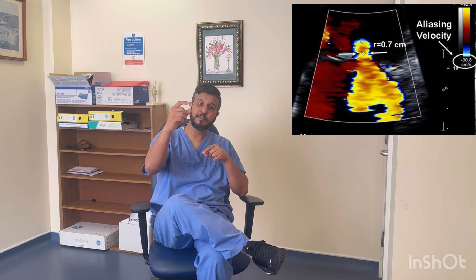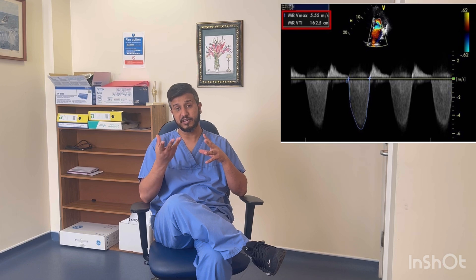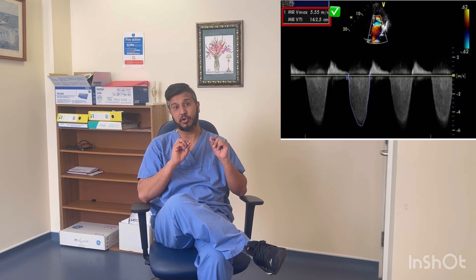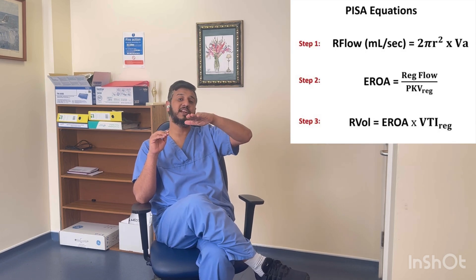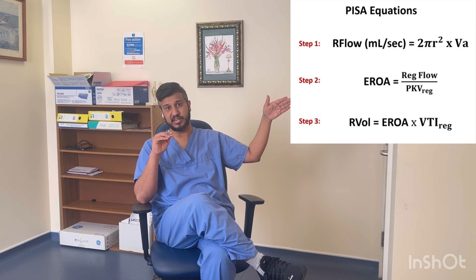In the PISA calculation, you measure the PISA radius, and the machine then asks you to measure the VTI of the regurgitation jet. When you trace the VTI, the machine automatically detects the peak velocity — it actually needs the peak velocity for the ERO calculation. The reason the machine asks for the VTI is so it can automatically calculate the regurgitation volume as well: it detects the peak velocity to calculate ERO, then multiplies by the VTI.